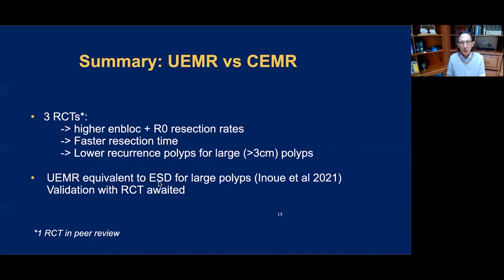UEMR was found to be equivalent to ESD for large polyps, and we await validation in a randomized controlled trial.